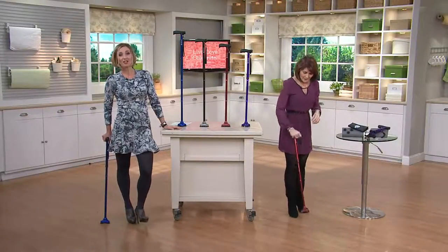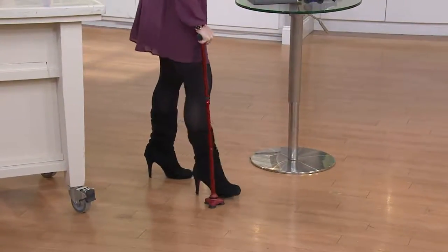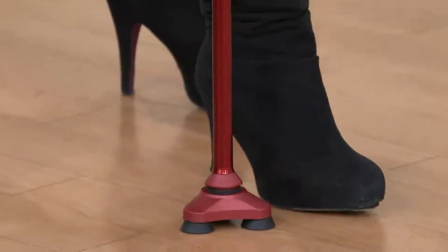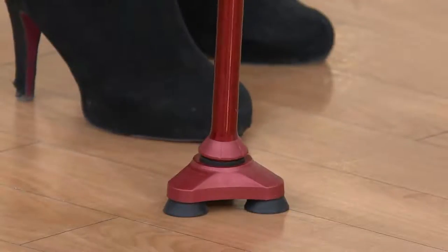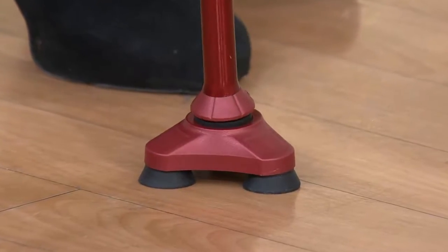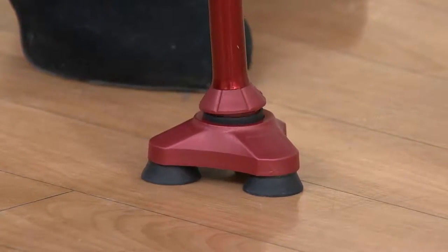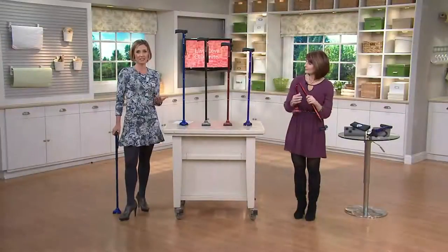It's happening younger and younger these days that there is a need for canes, and it's not something you should be ashamed of or embarrassed by. Most Americans these days are not just giving into aging — they're getting knee replacements, hip replacements, wanting to extend the life of their bodies, which is great, but you've got to rehab from that. Get something that's going to help you do that. The cane could be for you during rehab, or it could just be a part of your day-to-day life as you age.